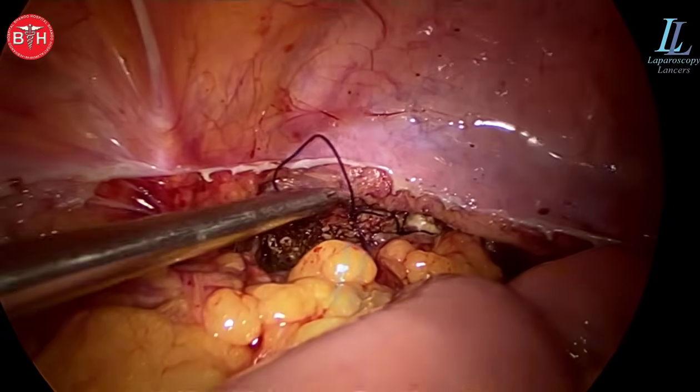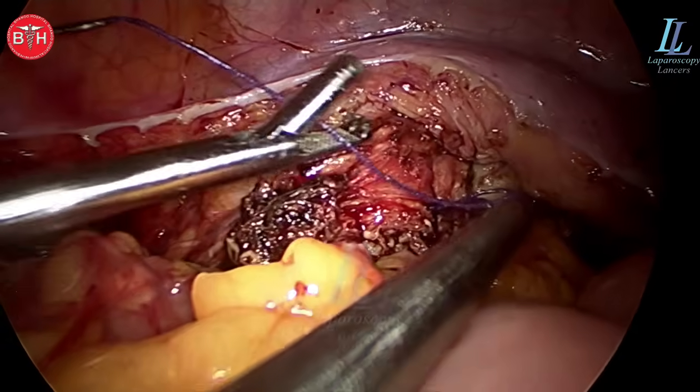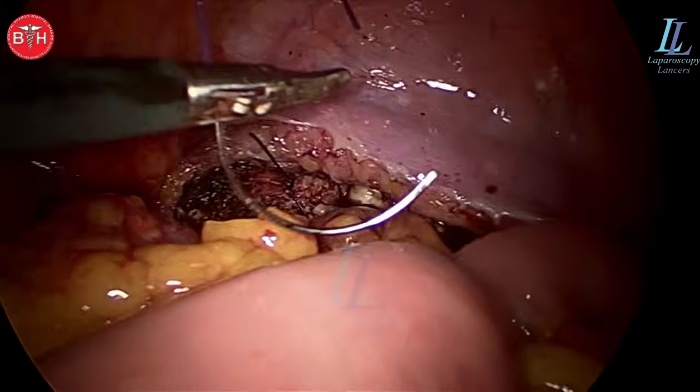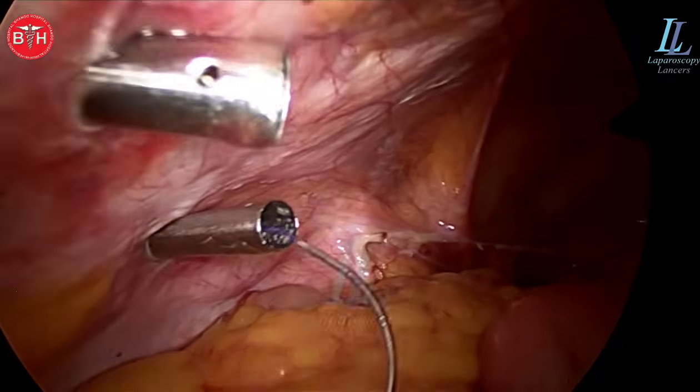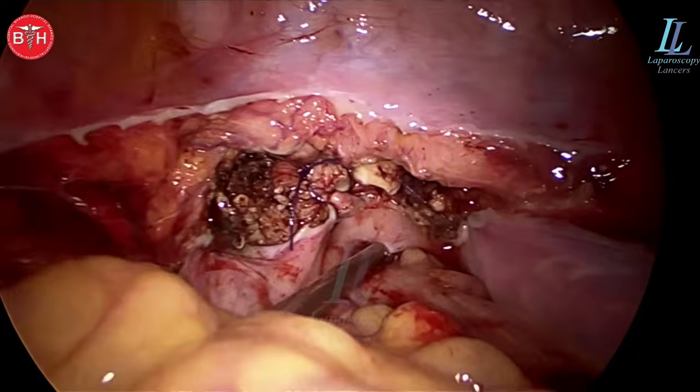The patient is in 15 degree head-down position, low-pressure pneumoperitoneum at 10 mmHg. There you can see the ritual of cutting the loop — I don't know why we cut the loop as this omentum will never get stuck here. That's the five millimeter port, a bit of wash — that's all.